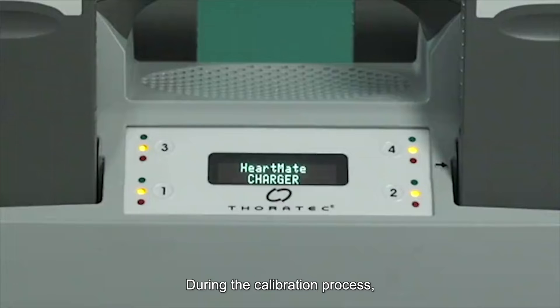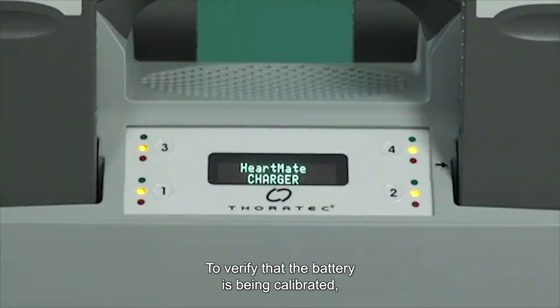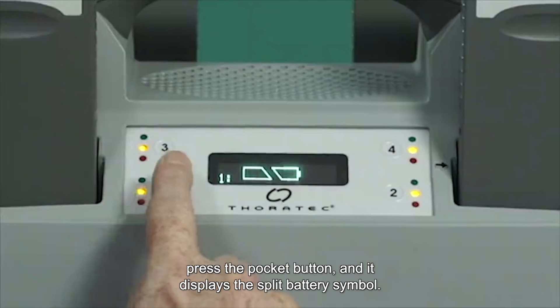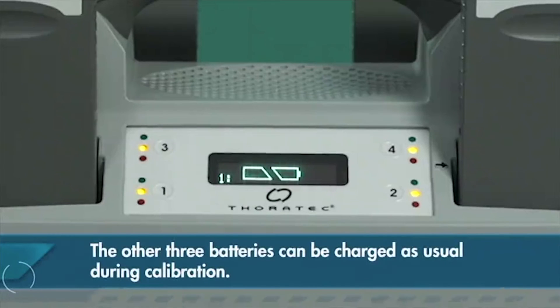During the calibration process, the charger drains the battery of all electrical energy and then recharges it. To verify that the battery is being calibrated, press the pocket button and it displays the split battery symbol. The other three batteries can be charged as usual during calibration.